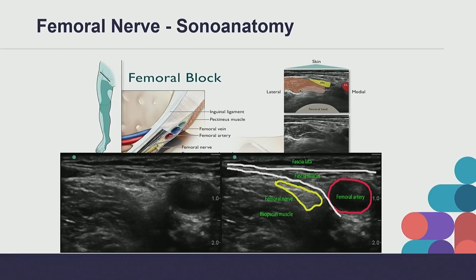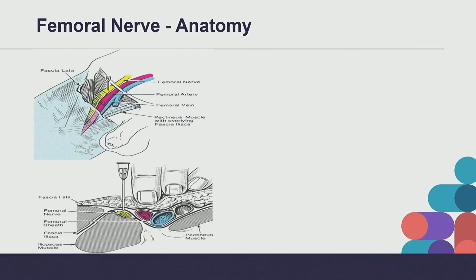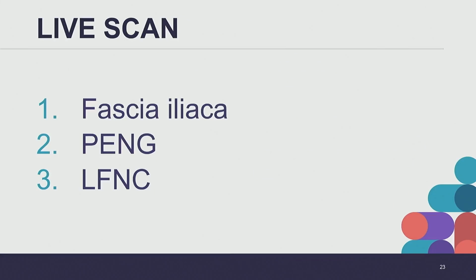Do we have it fixed now? Okay. So we'll pop back to the scanning session, and then we will resume the femoral nerve block. Thanks for bearing with us.